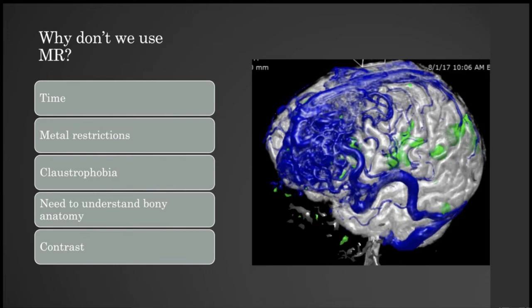And then obviously the contrast application. Some of the sclerosis side effects of repeated gadolinium administration have been purported, and that's why over the last 10 years we've probably seen a lot more restriction on renal clearance and even gadolinium. But more recently, the metal restrictions came up, even yesterday in our providers meeting for stroke. We talked a little bit about trying to get rapid stroke protocols done in patients who had pacemakers and things like that.